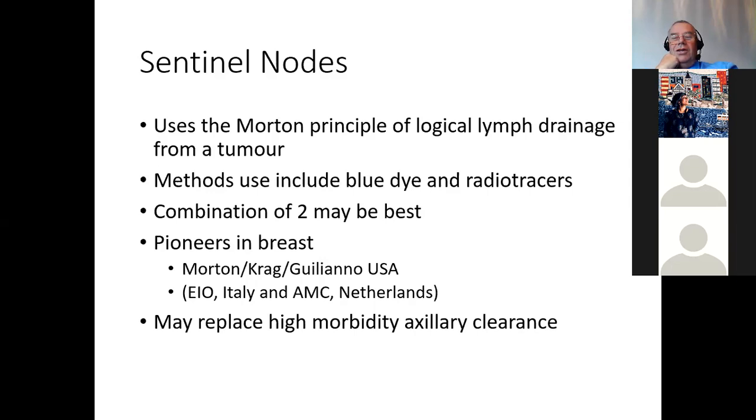You can imagine that if you think of the service stations as the lymph nodes, you can find those with the probe, and then the blue lines that you get with the methylene blue are your motorways. It's very much easier then to find the nodes by just tracking along the blue lines till you hit a high signal.